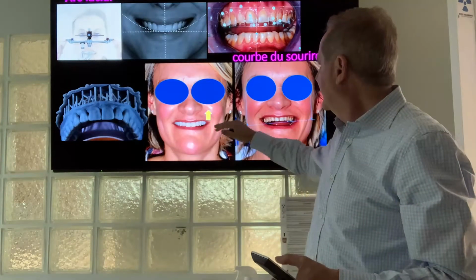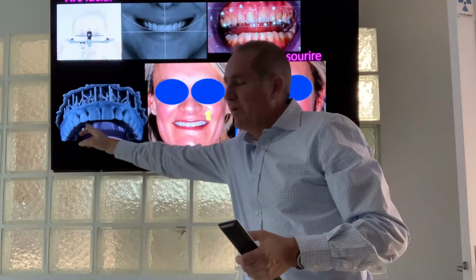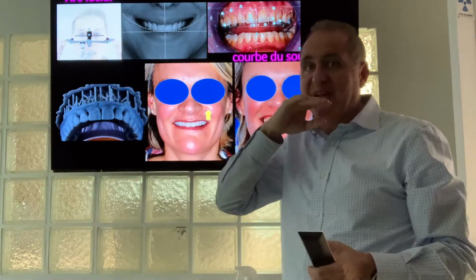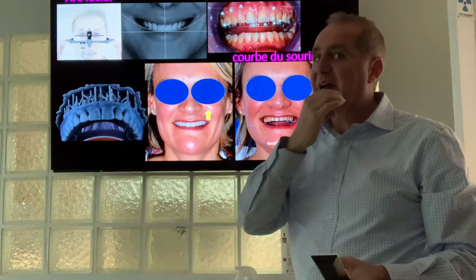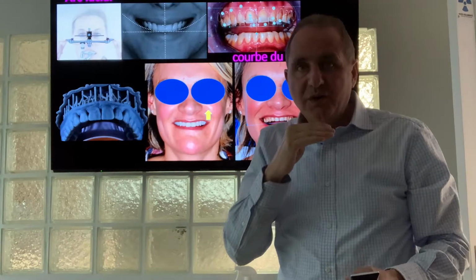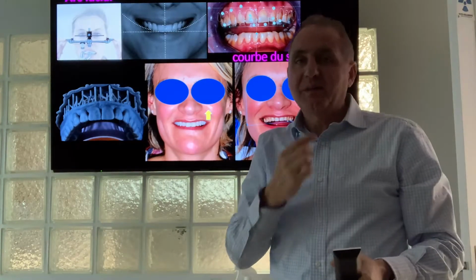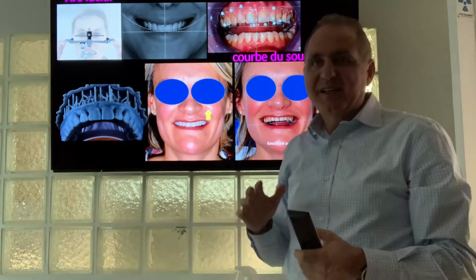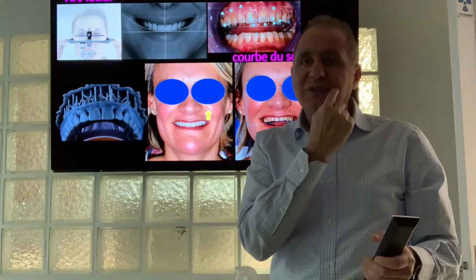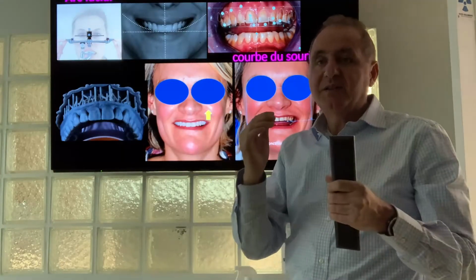And we see all the discrepancies about it, how we have to deal, and we have all our mock-up done and finished, and the patient said, okay, I like it. You see how much she can show her teeth, how much it is nice for the curve, the banana curve, and if everything is okay, according also to the dynamic of the lips when she smiles, if it's not too long, too wide, okay?